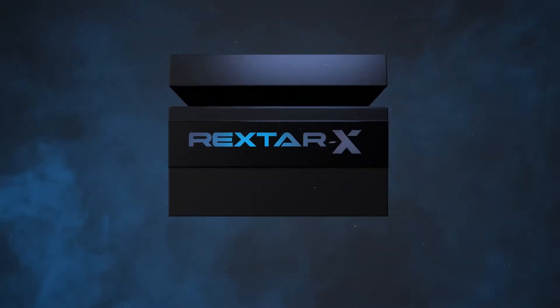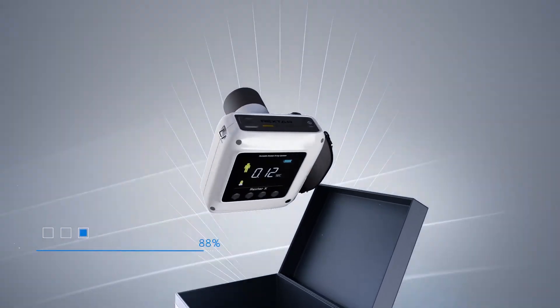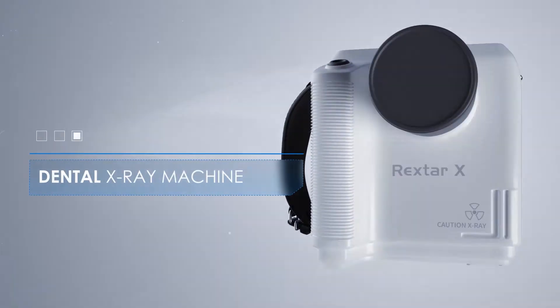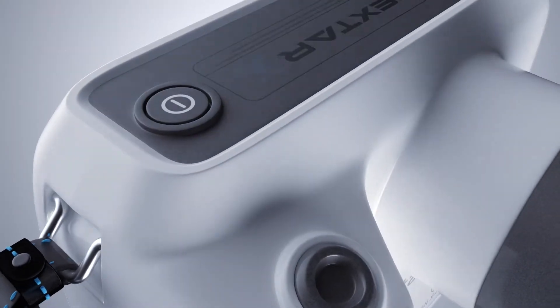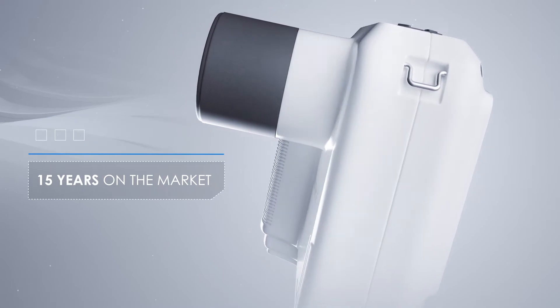A unique new tech device: Rextar X. This is the most popular portable x-ray machine used in dental clinics around the world. The secret of success is time-tested quality and reliability. After all, the Rextar X device has been in demand on the market for 15 years.